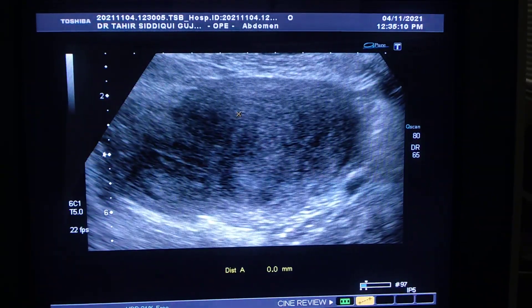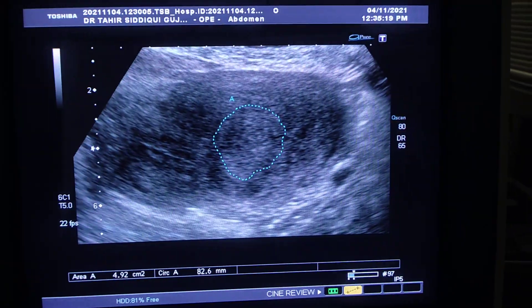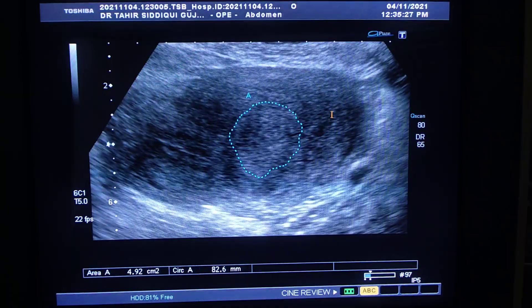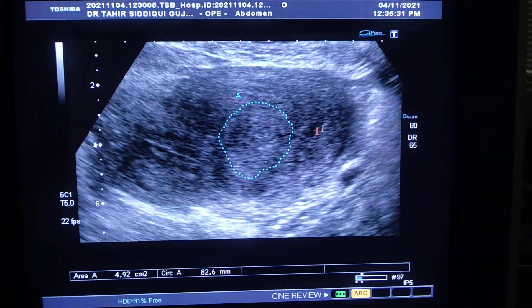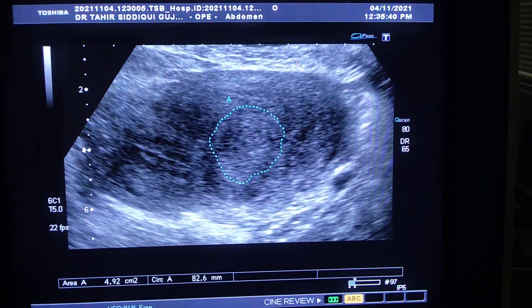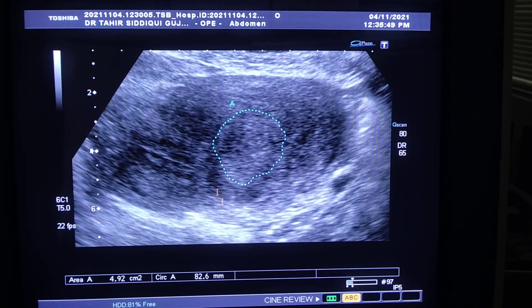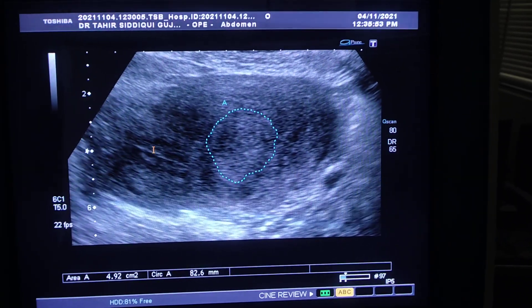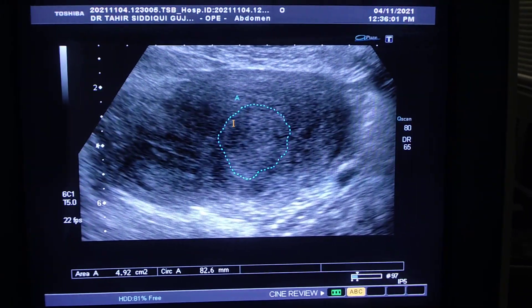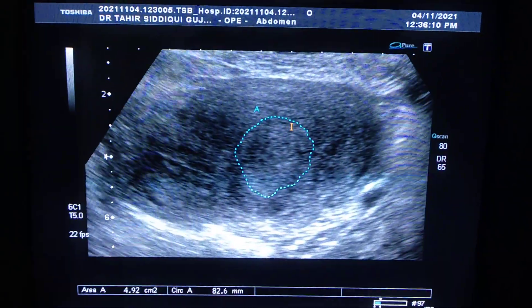This is the fibroid. If you look carefully, there are two horns — this is the endometrial canal on the left side and this is the endometrial canal on the right side. There are two. There is no indentation at the fundal region, so this is in fact a subseptate uterus, with the endometrial canal separating into the right and left one. Within this groove, in the submucosal location, we do see part of a solid, highly echogenic, vascular fibroid.